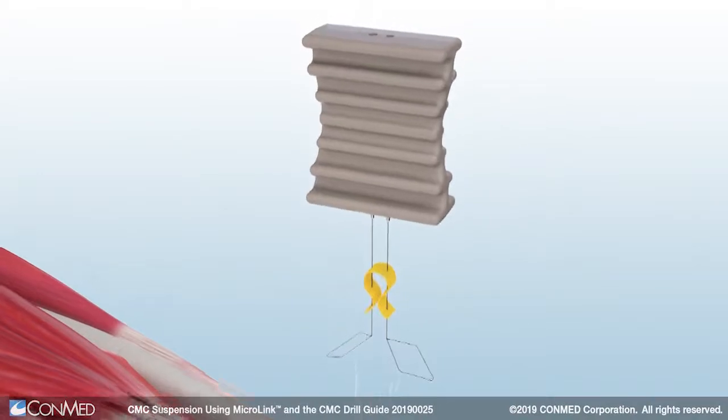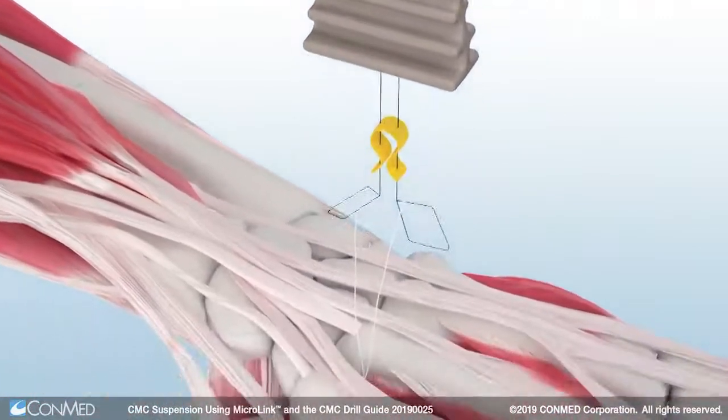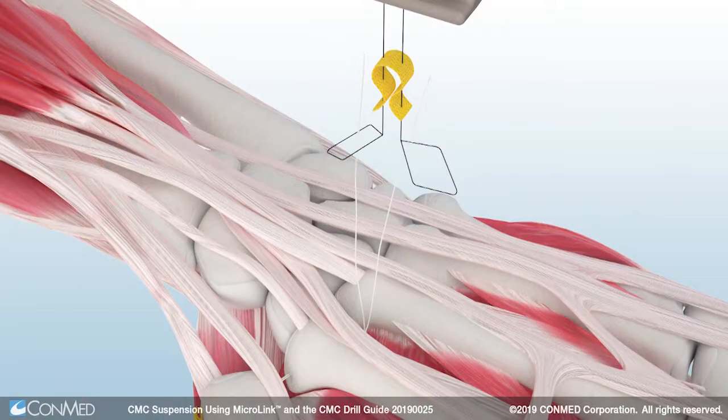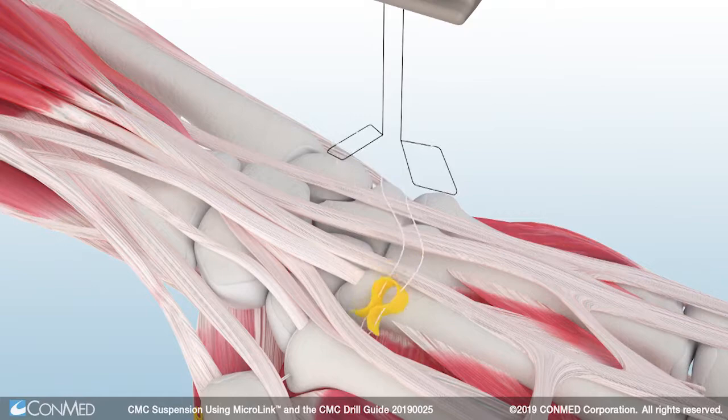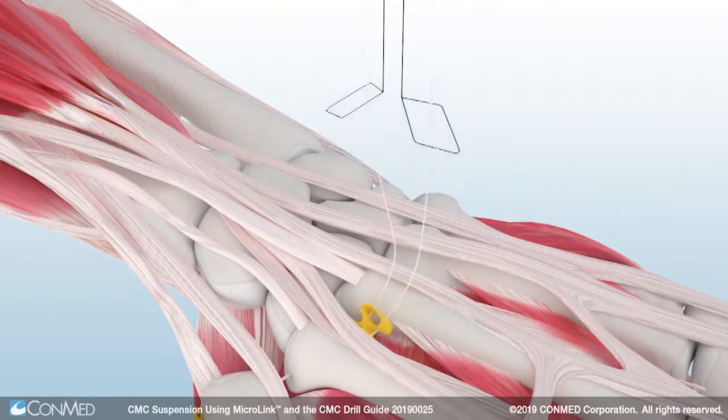pass at least three centimeters of each number two hi-fi suture tail through the nitinol loops found on the backstop loader. Gently slide the backstop off the loader and onto the suture limbs. A half-throw can be used to advance the backstop down to the index metacarpal.